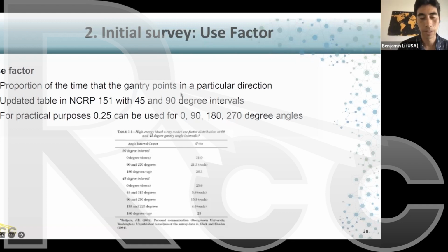Yeah, and if I were to build off of that, one of the main takeaways from this presentation is you have your vault with your Linac. If you have been doing mostly 3D conformal treatments, and now you've transitioned to IMRT, IMRT has a lot more MUs.